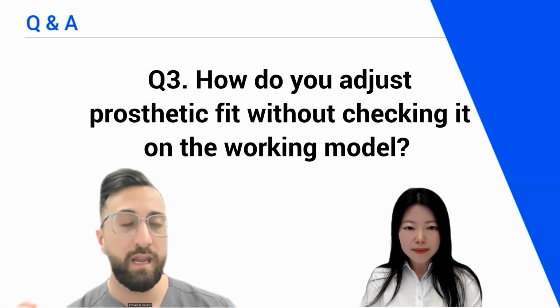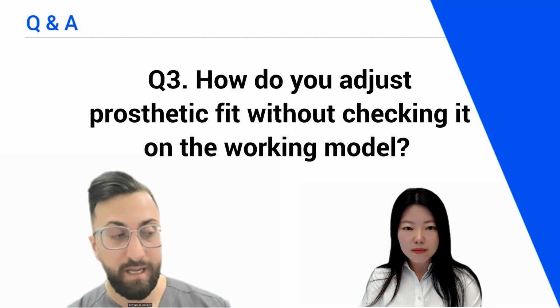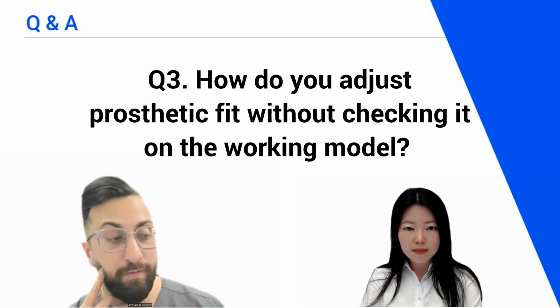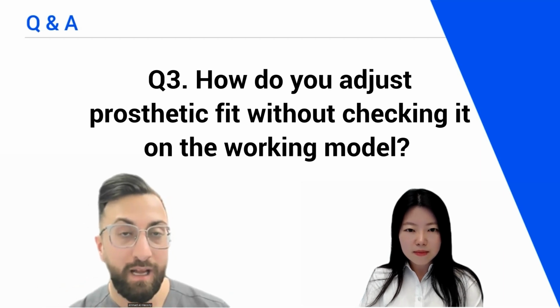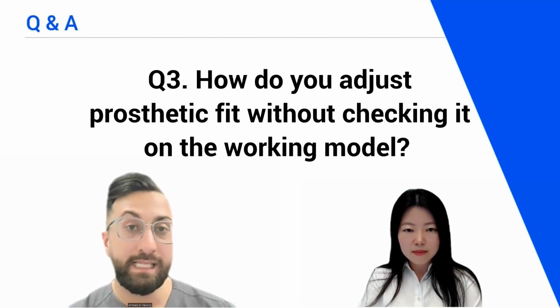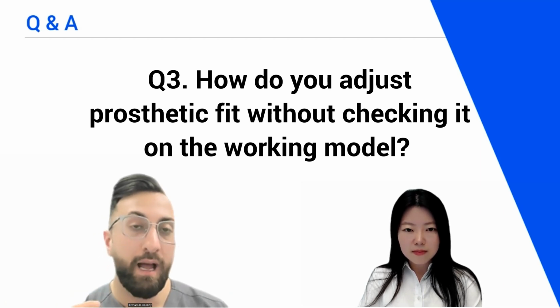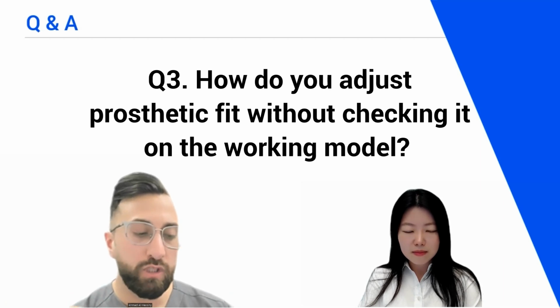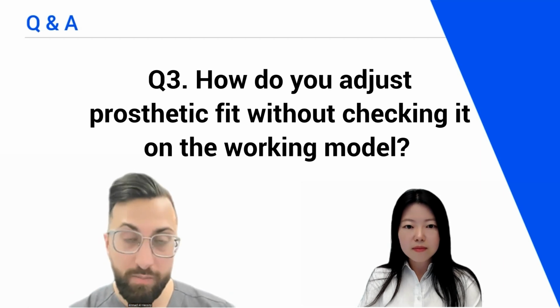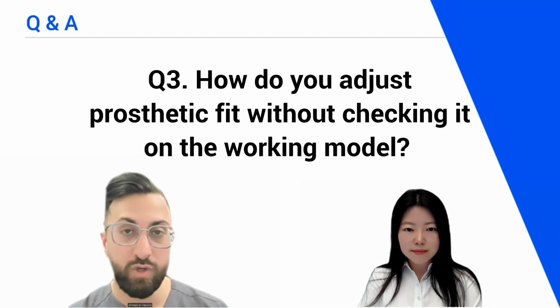So if you're not using a model, really the only other way is using something like crown fit, but even that needs some model and some scans of the model, or at least the preparation itself. The reality is, if you want to check the fit, you either check it intraorally or you print a model and you check it on the model. That is the 2 best ways.